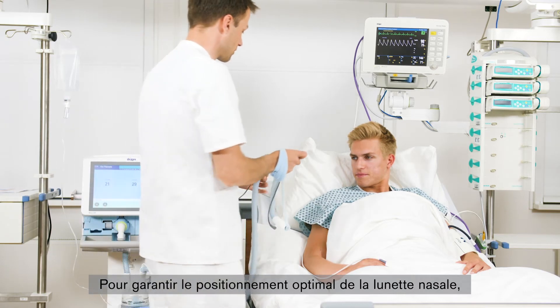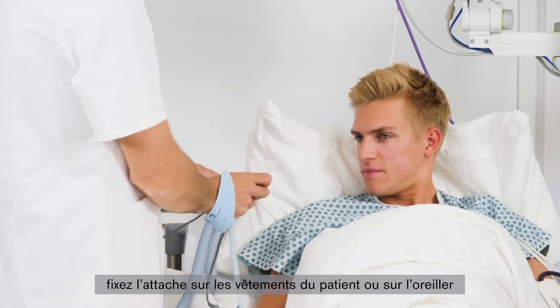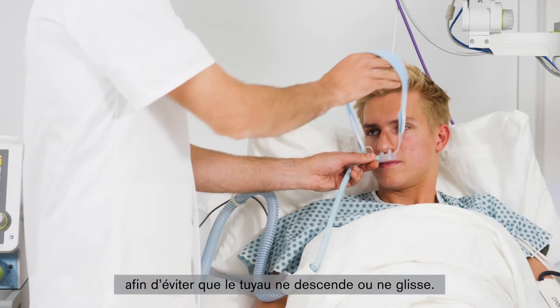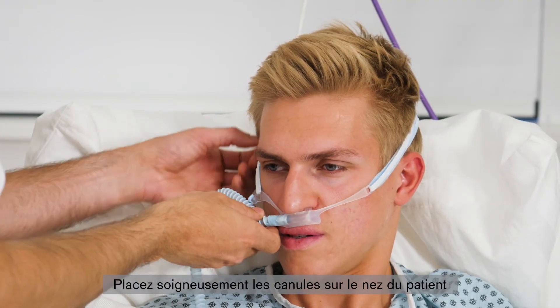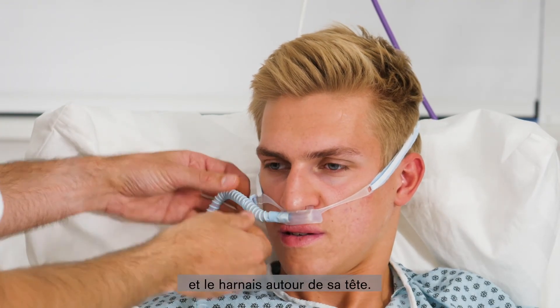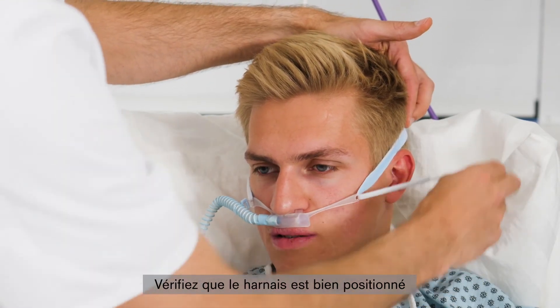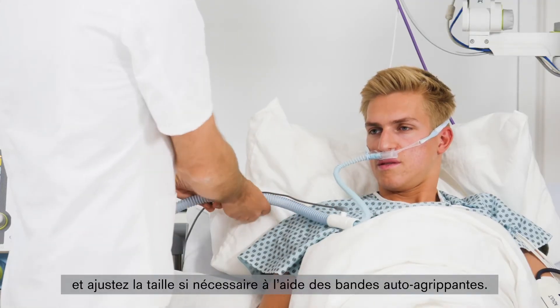To ensure that the nasal cannula remains optimally positioned, fasten the bed clip to the patient's clothing or bedding to prevent the hose pulling down or slipping. Carefully place the prong in the patient's nose and then place the headgear around the patient's head. Check the headgear is positioned correctly and, if necessary, adjust the size using the hook and loop fastener.